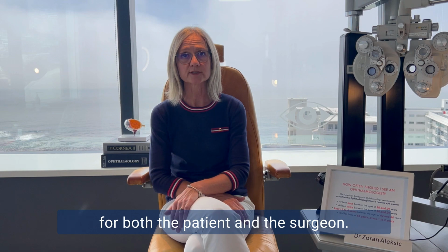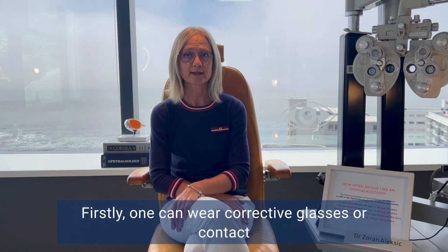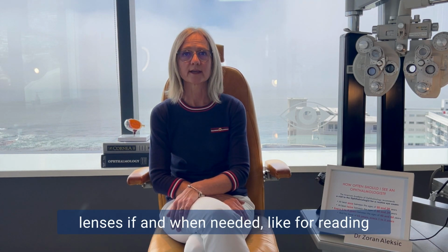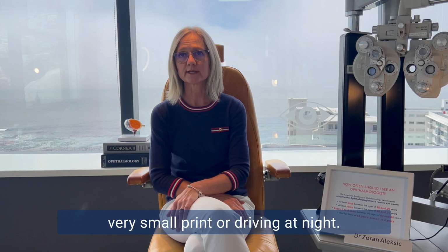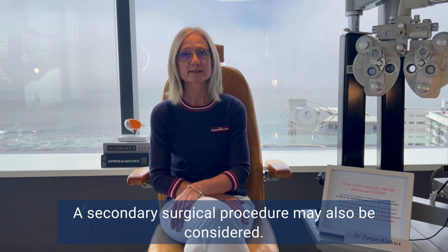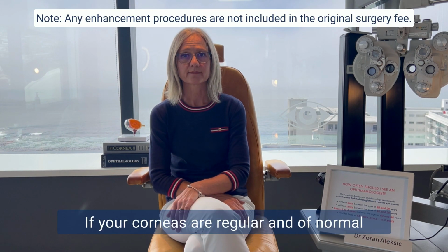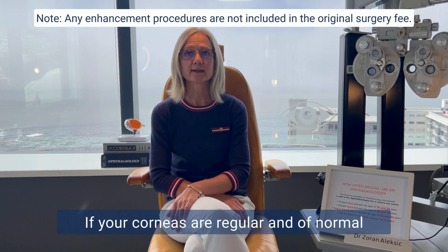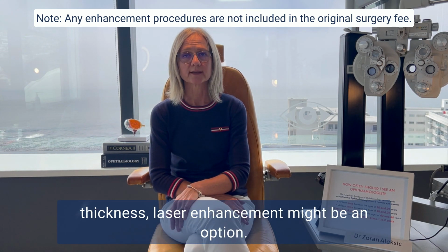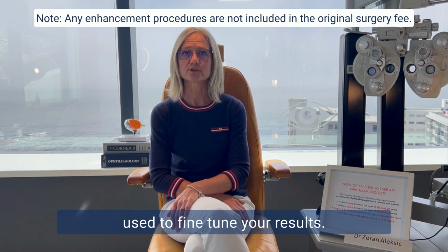In cases where we do not achieve the desired post-operative refractive result, and it is unsatisfactory for both the patient and the surgeon, there are ways to enhance your vision. Firstly, one can wear corrective glasses or contact lenses if and when needed, like for reading very small print or driving at night. A secondary surgical procedure may also be considered. If your corneas are regular and of normal thickness, laser enhancement might be an option. Alternatively, a piggyback lens implant can be used to fine-tune your result.